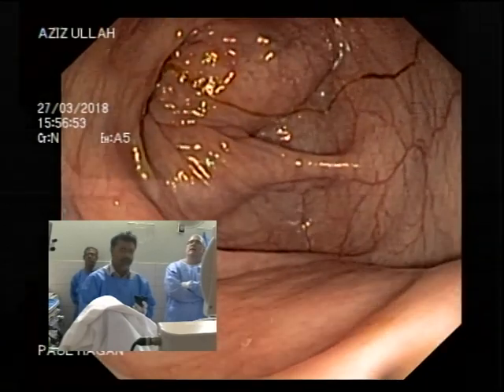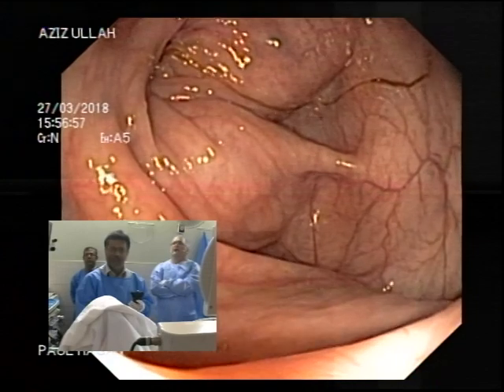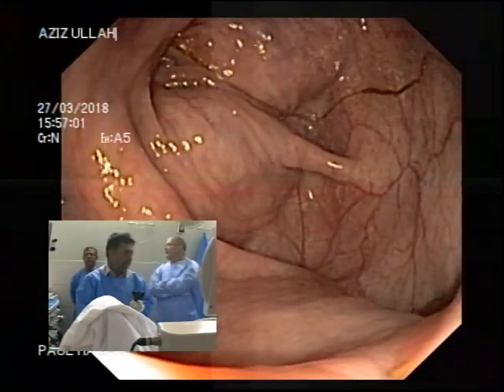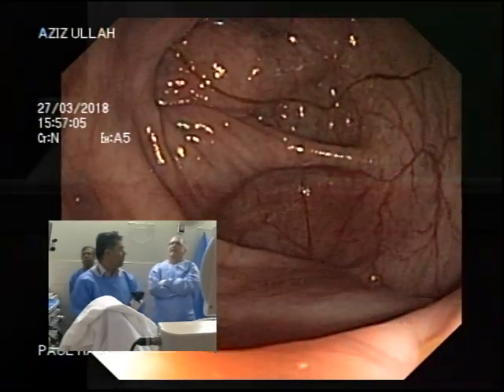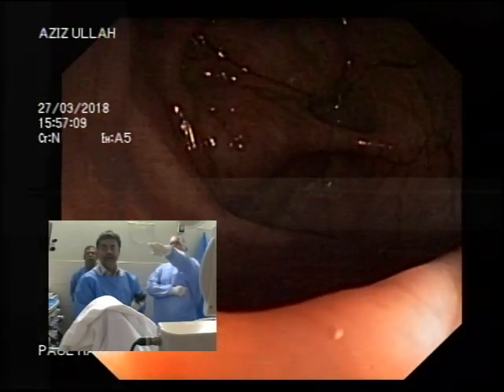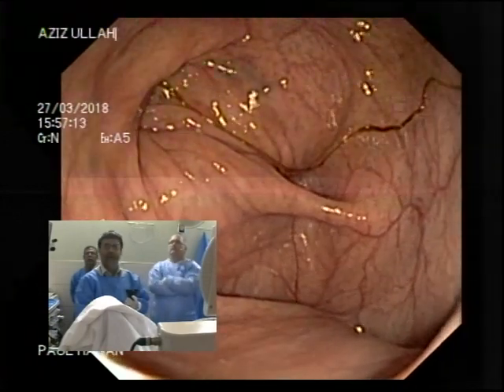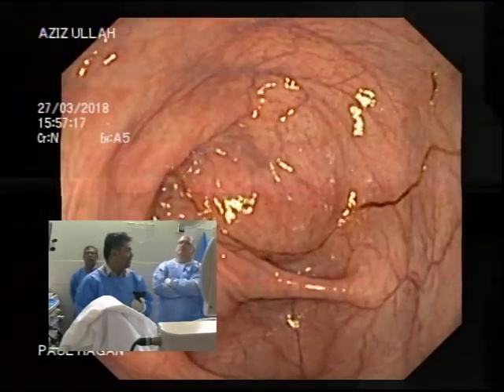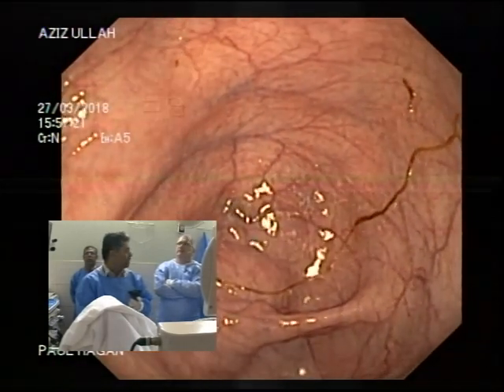That's all right. Bahut ho raha hai, thoda sa ho raha hai. What's he say? He's complaining of pain. Whenever we have that complaint, I used to suck a few ml of... You can't suck because you're against the wall. No, not at the time. When I was higher up, I will suck if he's a little bit better. Right. So it's better to suck whenever the patient complains of pain.